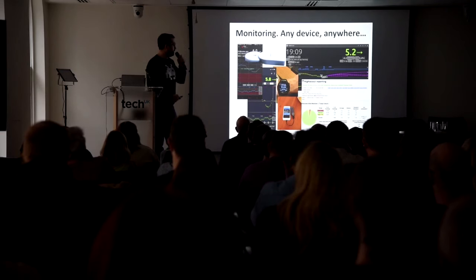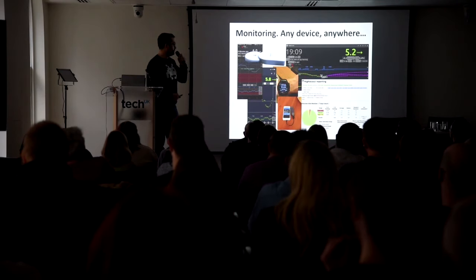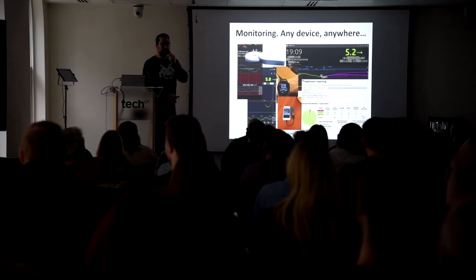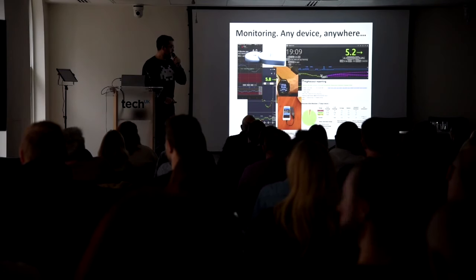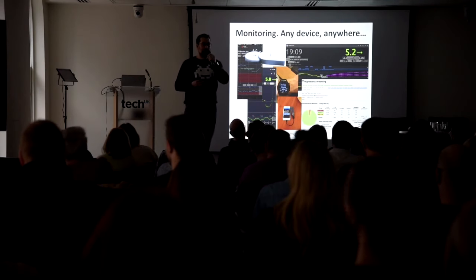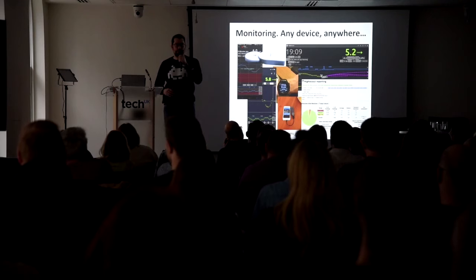We've got Android APS, not yet got Android APS. We've got Xdrip, we've got Spike, which is new in the last 12 months. And Spike is effectively like Xdrip for your iPhone. You don't have to use the Dexcom app, which is great. You can control your alerts.